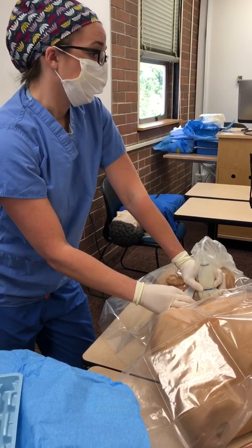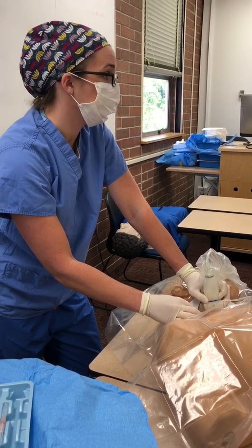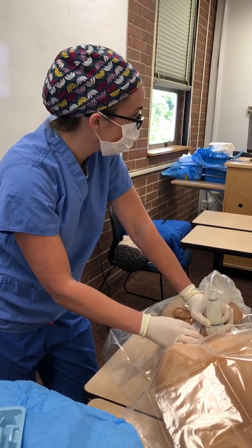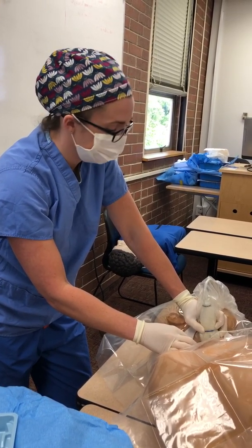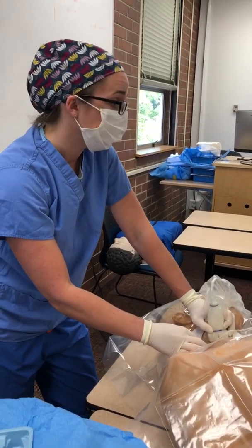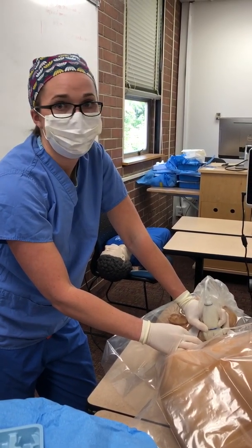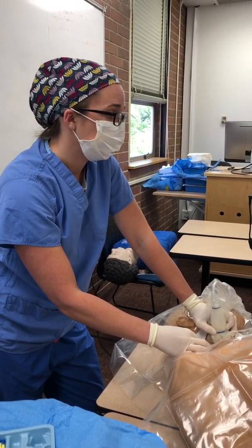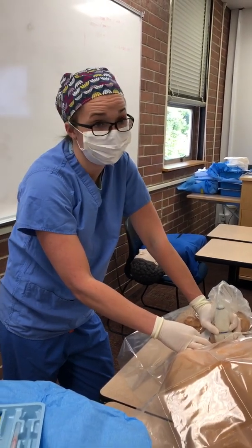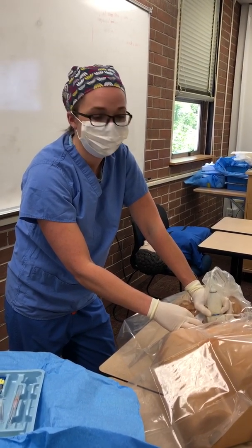So again, I'll be watching the ultrasound to guide how much fluid I give, but I'll start giving it in 3 to 5 ml amounts, aspirate, give 3 to 5 mLs, and I'll be watching the ultrasound and watching it hydrodissect around those nerves. I can reposition it and make sure I get it nicely around C5, C6, and C7. And again, for a drug, it would really depend on what facility we're at, but we'll say for this purpose, again, it was 0.25% Marcaine with 4 milligrams of dexamethasone mixed in. So total volume could be anywhere between 20 up to like 30 or so. It really depends on the individual. But again, I would use the ultrasound to guide that.